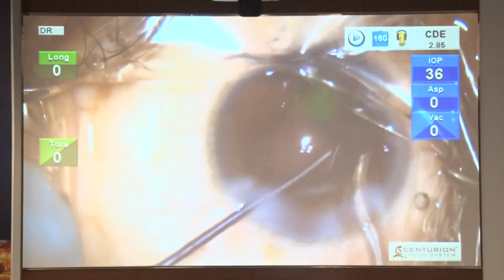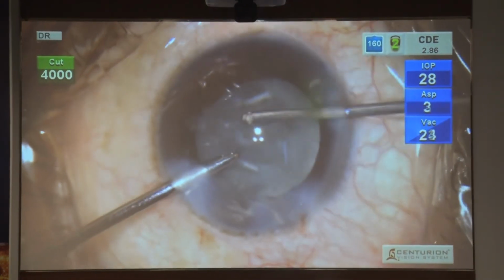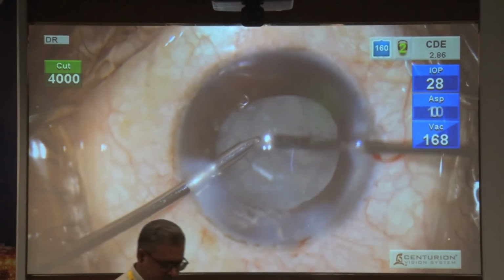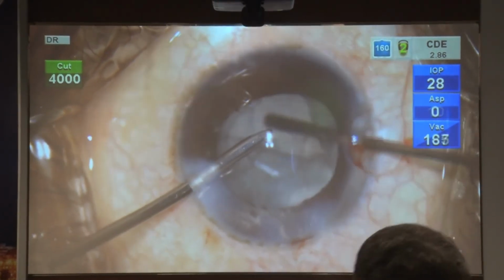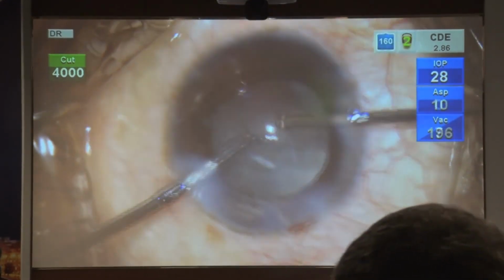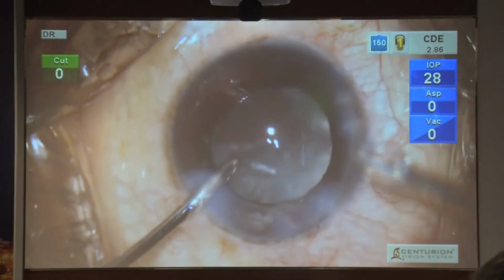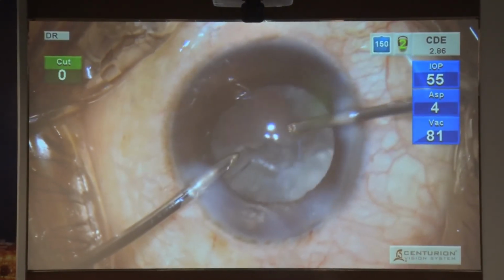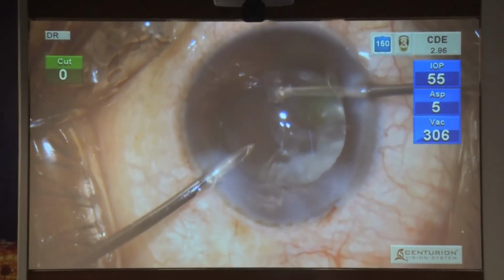So this is something which I got adventurous after seeing Osher's video, which said that the vitreous is a scaffold, and if the vitreous is formed, it's not going to allow the nucleus to drop down unless you churn it. And you churn it only by having higher fluidics. So the most important thing here is to decrease your fluid level that's going in and out. Drop down your flow rates, drop down your bottle height, drop down your vacuum.